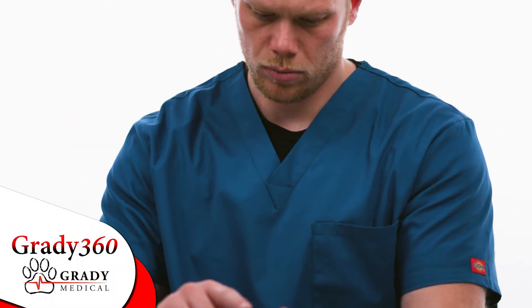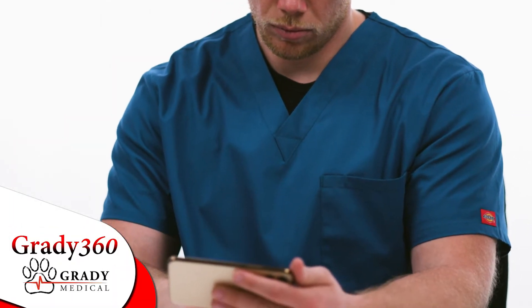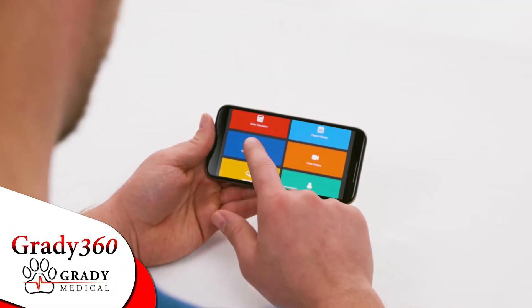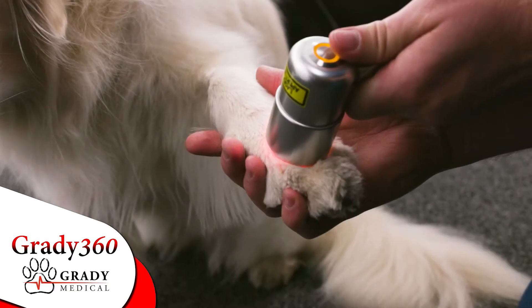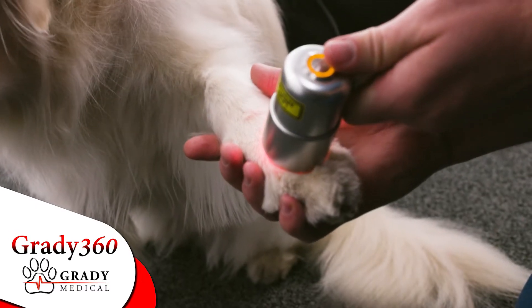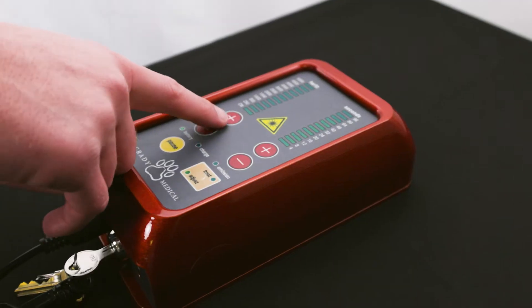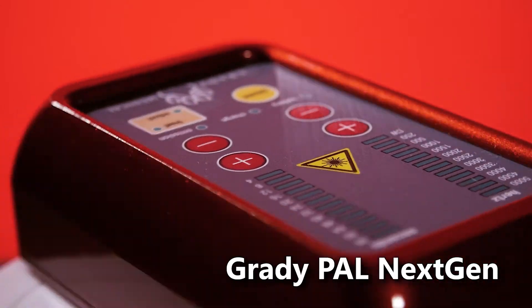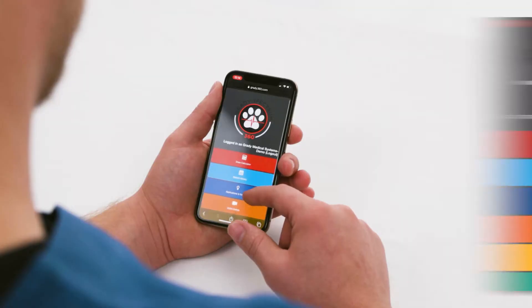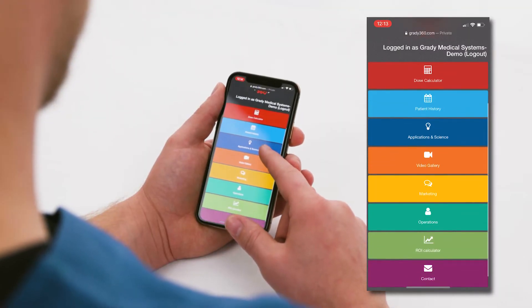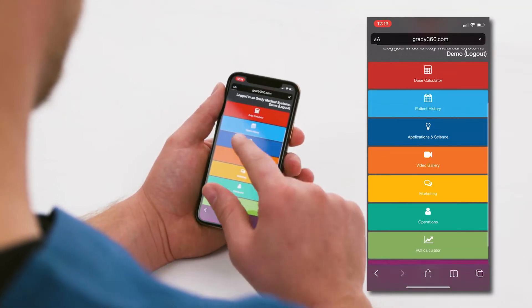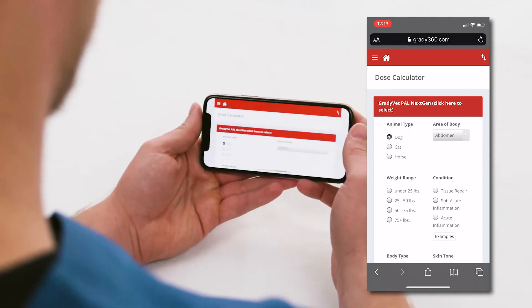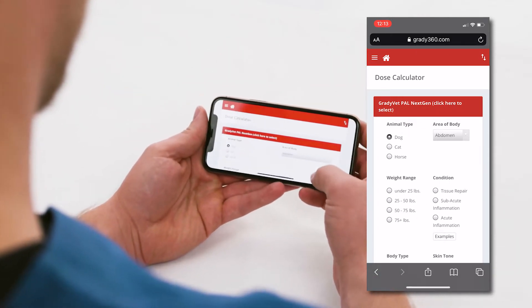Grady360 is a proprietary cloud-based software developed by Grady Medical Systems to provide accurate dosing for cold laser therapy treatments using Grady Medical's best-selling GradyPal laser line. The Grady360 web application features a built-in dosage calculator that generates treatment protocols simply and accurately.